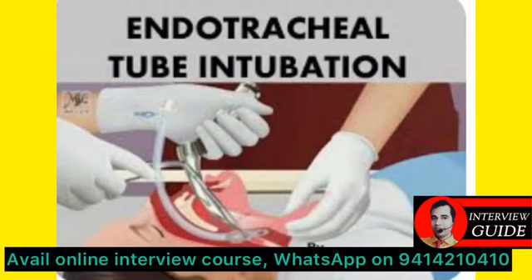Today I will talk about endotracheal intubation. There are some indications for doing endotracheal intubation: inadequate oxygenation or inadequate ventilation, the patient has some type of head injury, the patient has altered mental status, or the patient has any anticipated airway obstruction. In all these types of indications, we have to do endotracheal intubation.